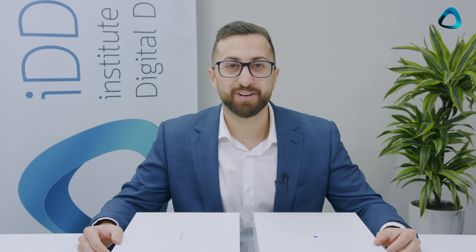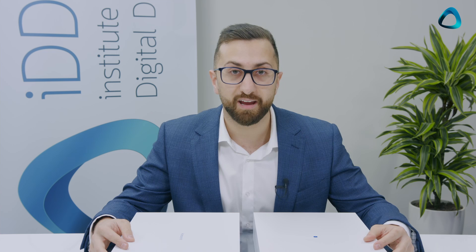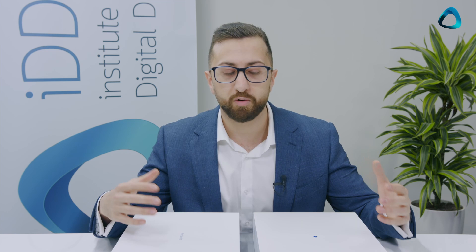Hey guys, my name is Dr. Ahmed Al-Hasni from the Institute of Digital Dentistry here in Wellington, New Zealand. What I have here is the Medit i700 — actually our second unit in the clinic and one of the few in the country. Today I'm doing an unboxing because when I got my first Medit i700, I was quite blown away with the number of accessories and different things you get. So I figured I'd share that with you today.